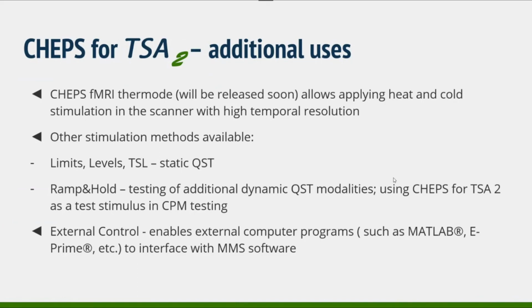And another capability that we reviewed in our TSA2 webinar, and I would like to just briefly talk about now, is the external control option.